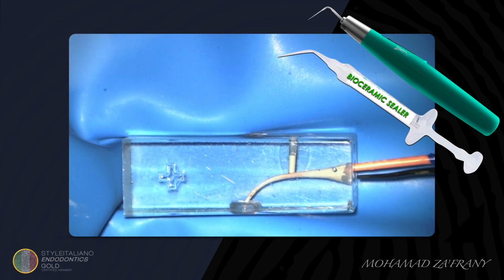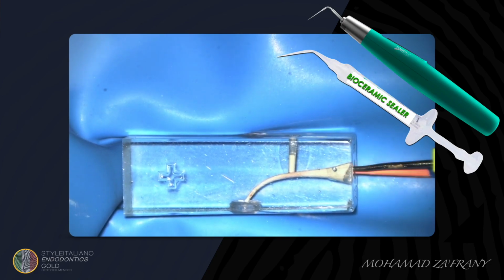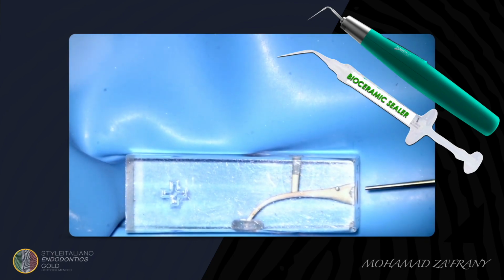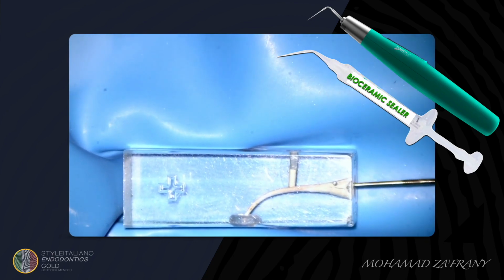With the heat carrier, just cut at the orifice level, and with a plugger you can gently compact the master cone.